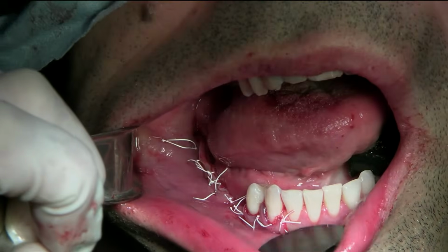Okay. We just completed the vertical ridge augmentation procedure in the posterior mandible using a combination of autogenous bone graft harvested from the ramus and mixed with a stable scaffold like a bovine xenograft, covered with a titanium reinforced PTFE membrane.